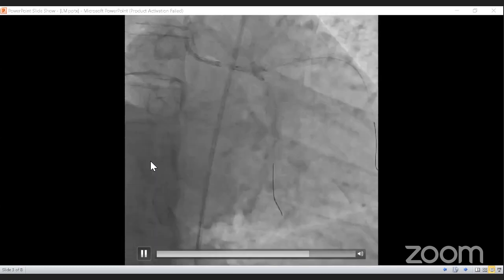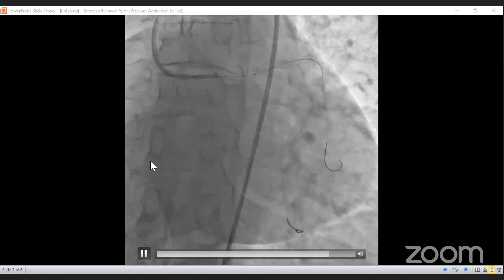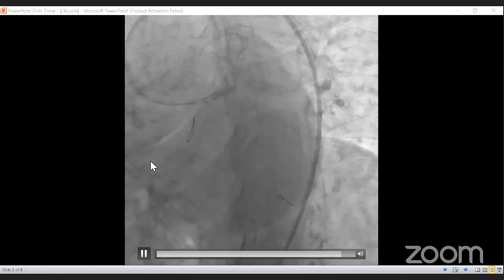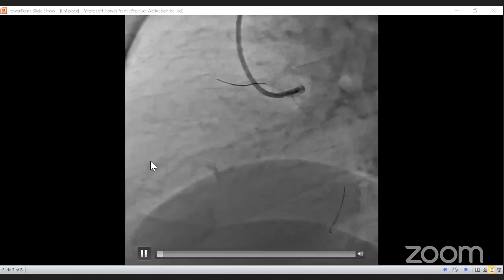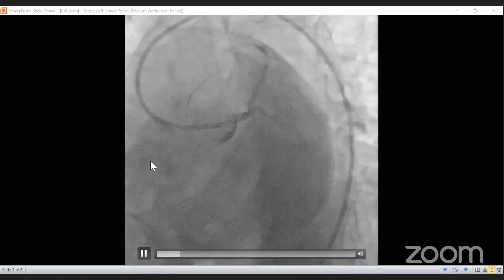Inflating a balloon, even if it is a 2 millimeter balloon, towards the circ will cause a deformation at the opposite side at the roof of the left main. So maybe after you do the inflation, you will do a POT, a side POT. The POT will correct this. But my rule is either to do the kissing if it is indicated, or not to deform the stent struts. Thank you so much, Professor Karim.